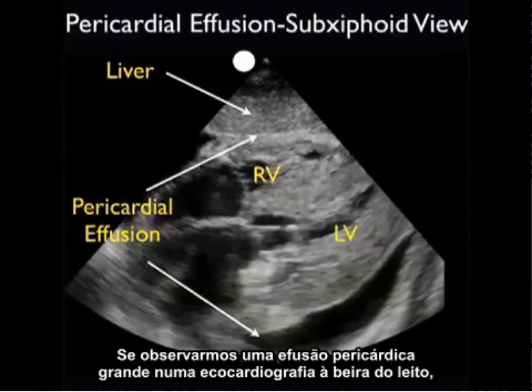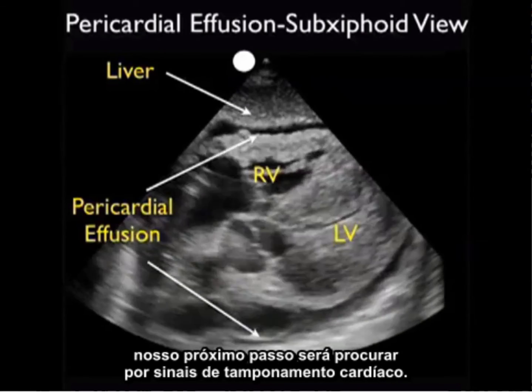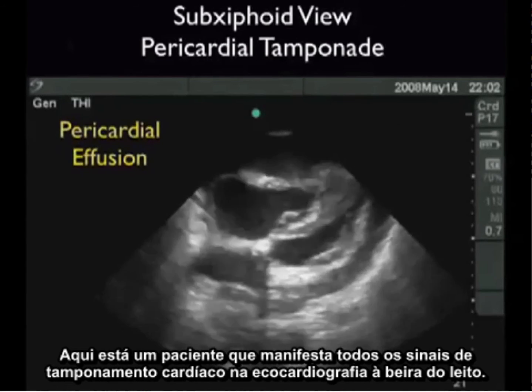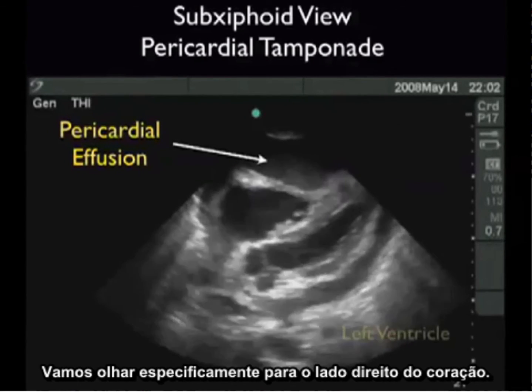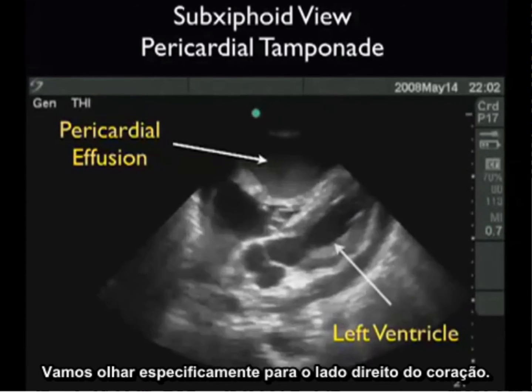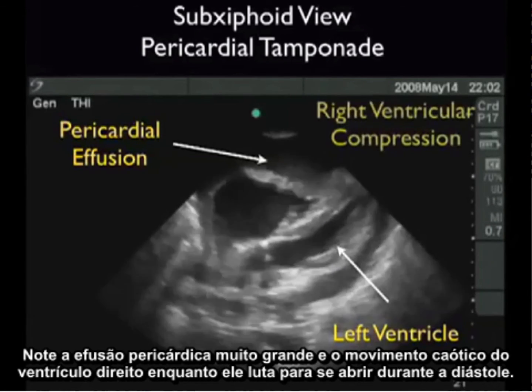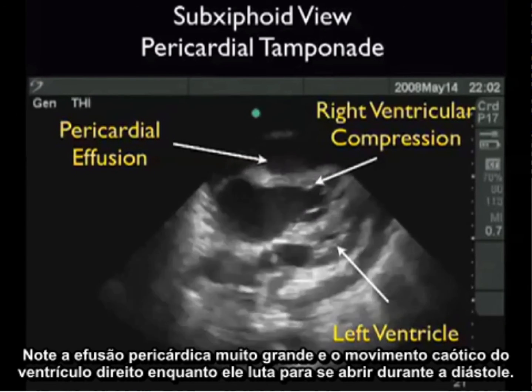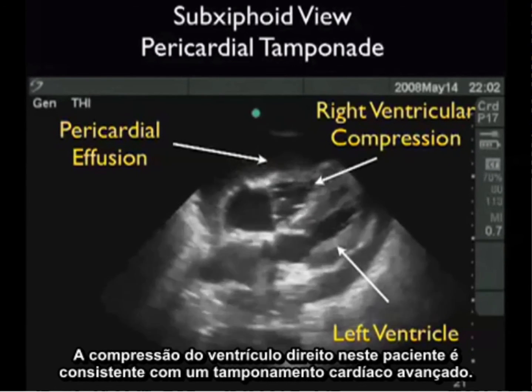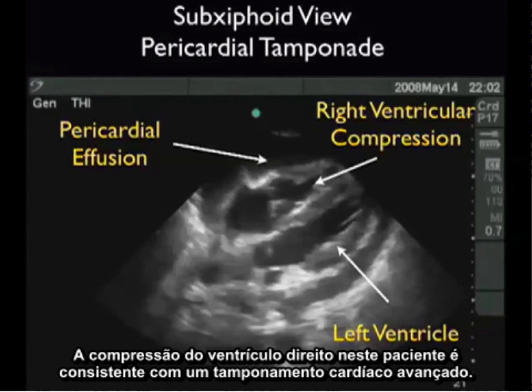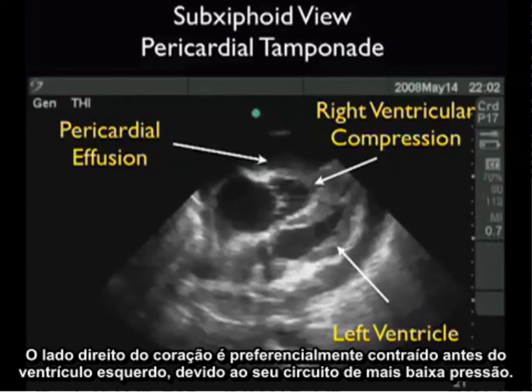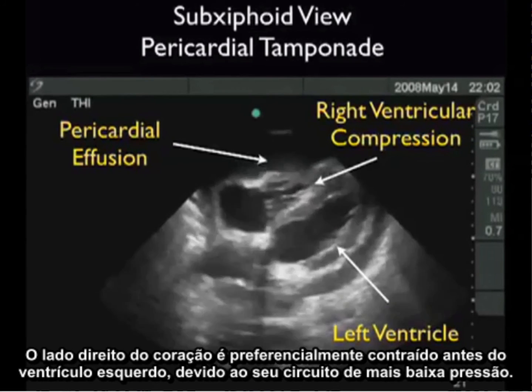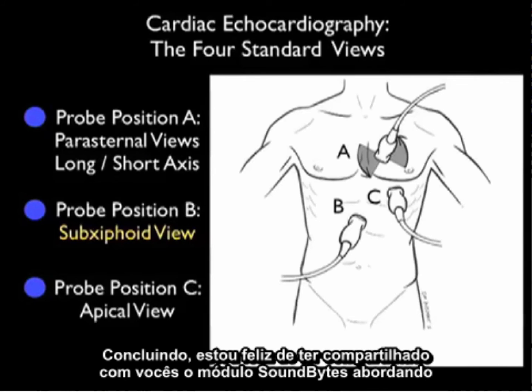If we see a large pericardial effusion on bedside echo, our next move is to look for signs of cardiac tamponade. Here's a patient who manifests all the signs of cardiac tamponade on bedside echo. Notice the very large pericardial effusion and note the chaotic movement of the right ventricle as it struggles to open during diastole. The compression of the right ventricle in this patient is consistent with advanced cardiac tamponade. The right side of the heart is preferentially compressed before the left ventricle due to its lower pressure circuit.